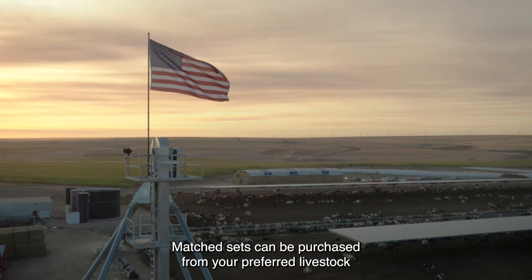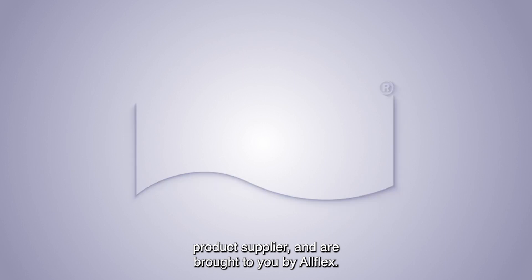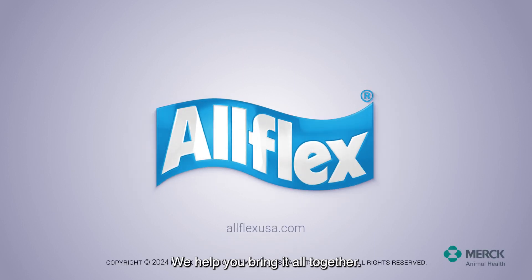Matched sets can be purchased from your preferred livestock product supplier and are brought to you by Allflex. We help you bring it all together.